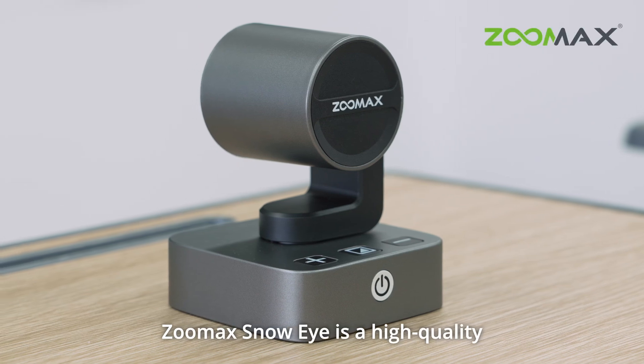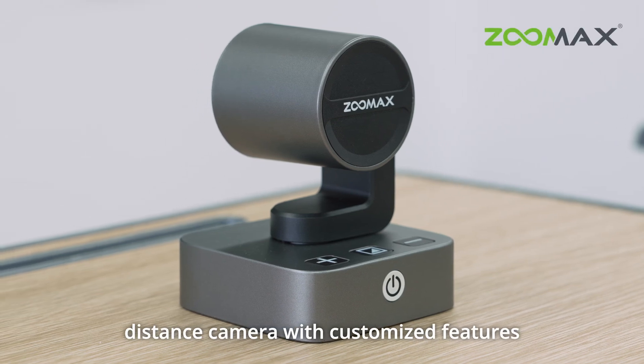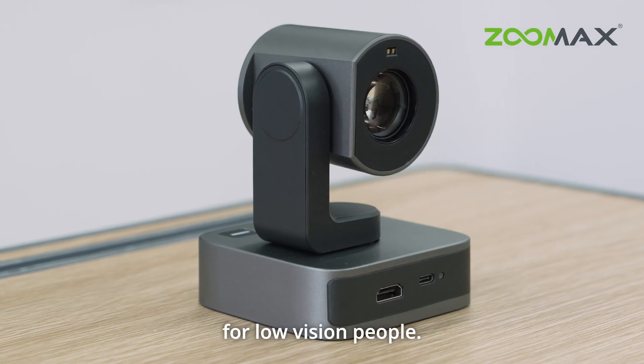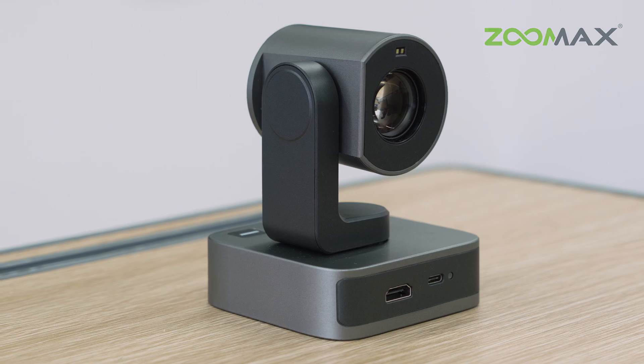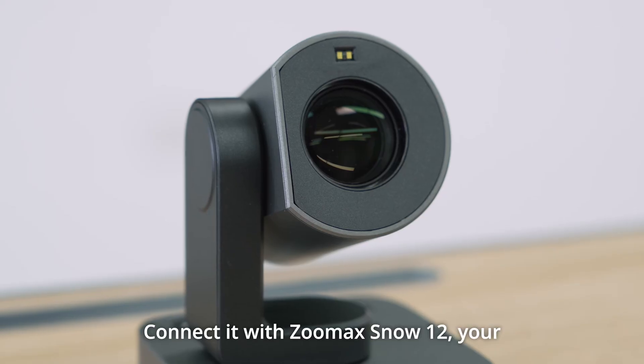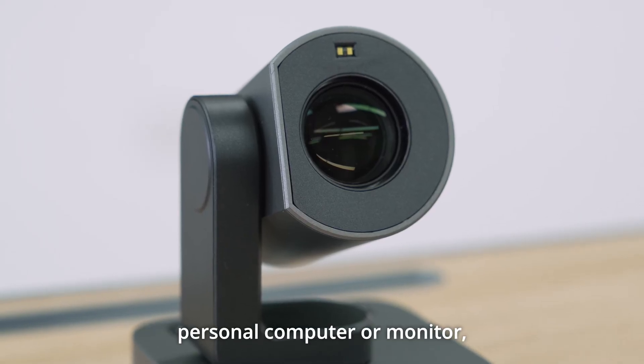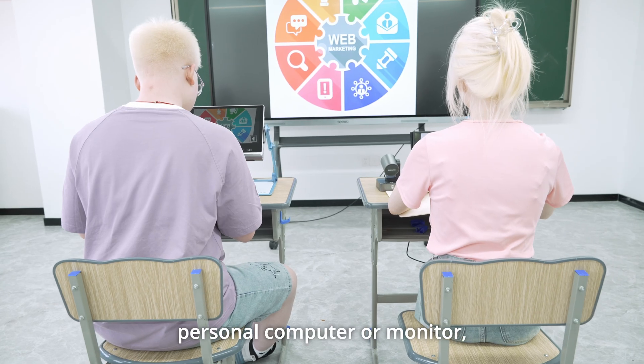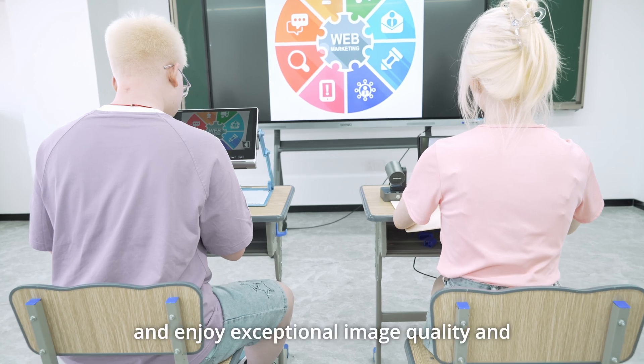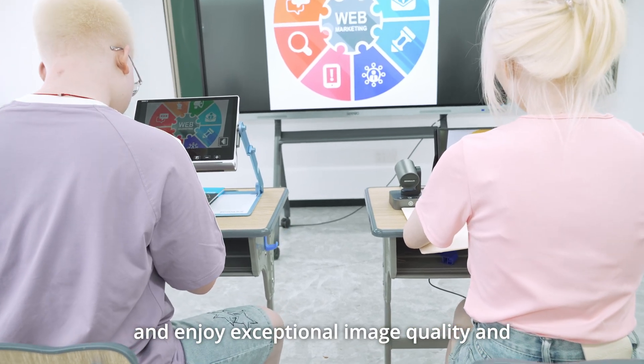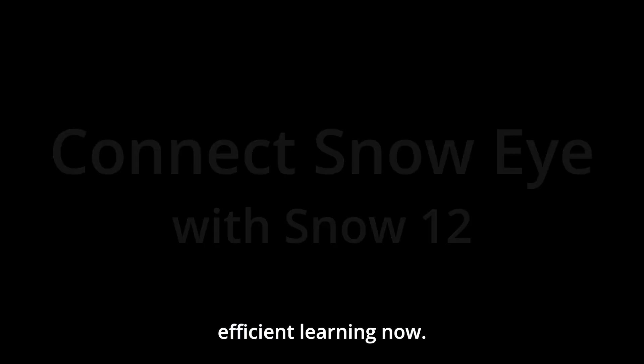Zoomax Snow Eye is a high-quality distance camera with customized features for low-vision people. Connect it with Zoomax Snow 12, your personal computer or monitor, and enjoy exceptional image quality and efficient learning now.